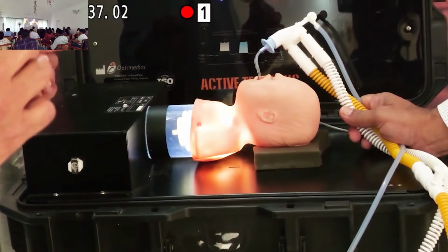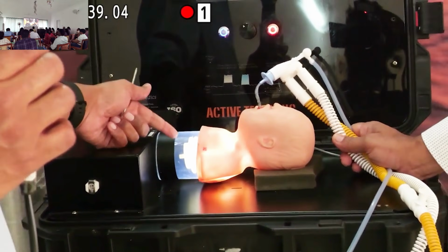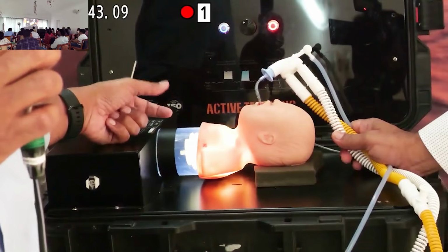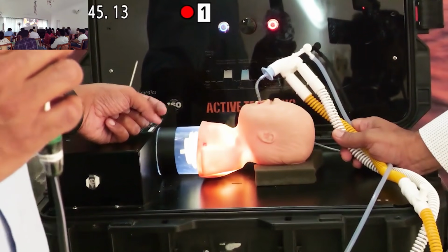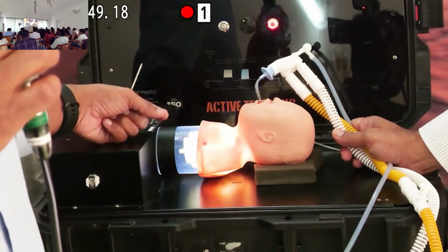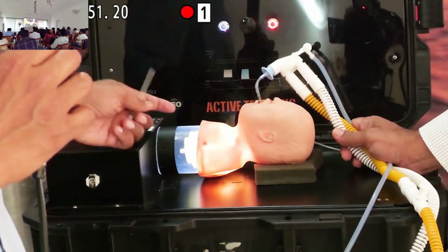So the cold light can be used. I mean, obviously in this mannequin we cannot show, but you're familiar with the cold light. If you don't have a cold light, Dr. Karthik suggested as well, you can just clean your iPhone and use the light, it is powerful enough. You have to switch off the room, darken the room, and then try the cold light.